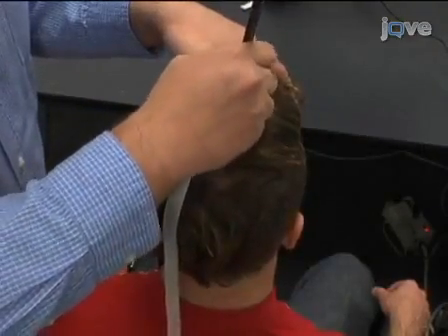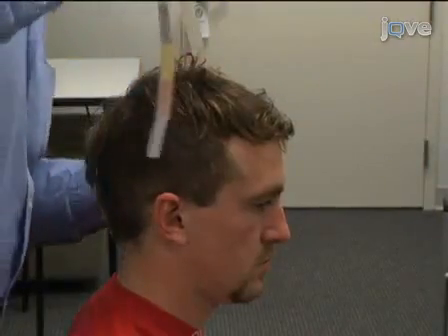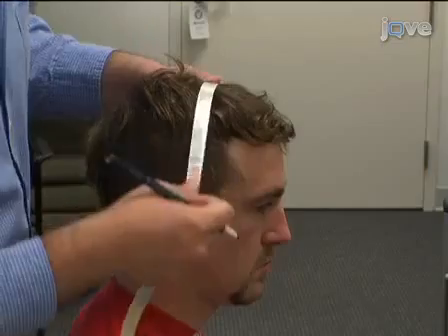Find the halfway point between nasion and inion, and mark it. This position is called the vertex.